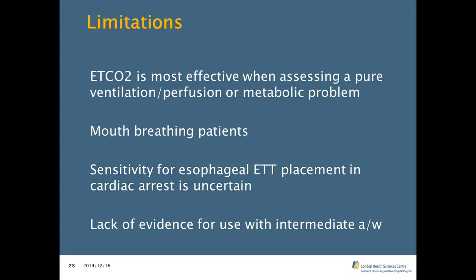So that means that you could get some EndTidal readout if you are in the esophagus, but you will definitely get one if you're in the trachea. With the esophagus, yes, you can get some EndTidal CO2 reading, but over time, if you're using capnography in the intubated patient, what you will see is diminishing CO2 output because you are in the esophagus. So that initial first few reads, you may get some CO2, but each waveform is going to be a lower and lower amount of CO2 until eventually zero, which tells you you're in the esophagus.